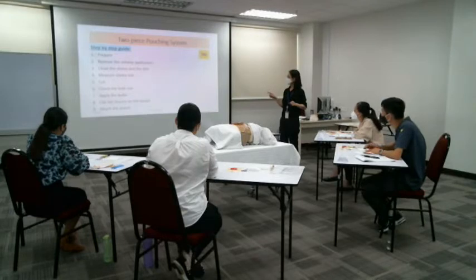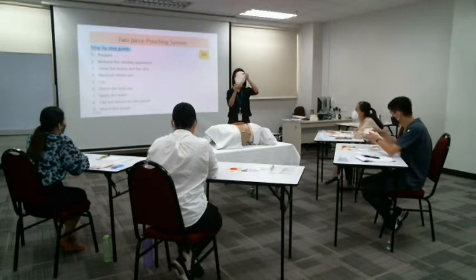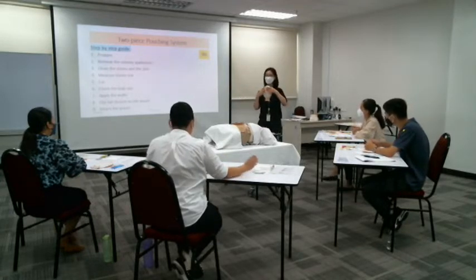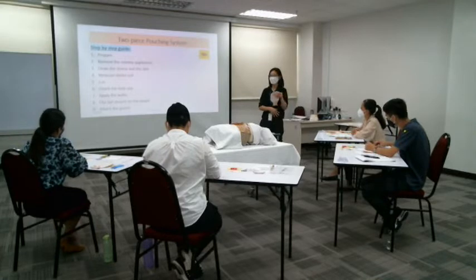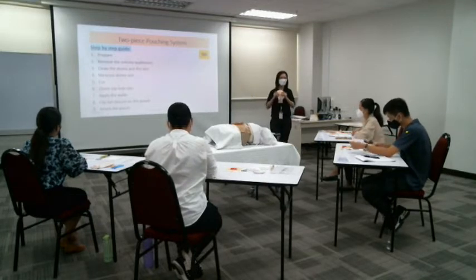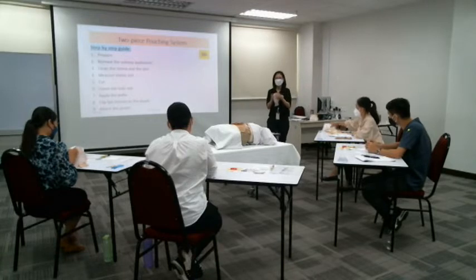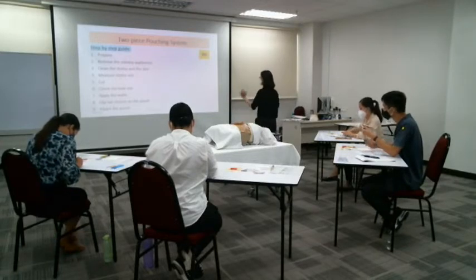After that, you clip the tail closure of the pouch. You prepare your pouch first by clipping it, then only you attach. Because remember, the output of the stoma is involuntary. If you don't close the end, while you are fixing and exerting some strength here, maybe the stool starts coming out. So you close the end first, then only fix. When fixing the pouch, you fix from bottom to the top, and make sure you press on it to hear the click sound. Alright? So I'll show you the video of the whole process.